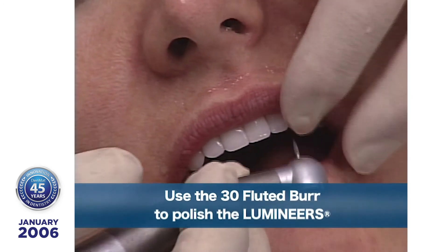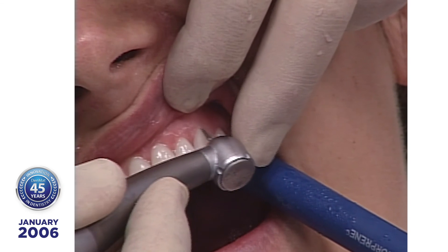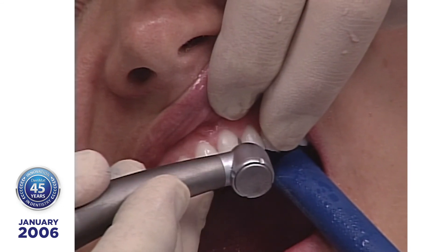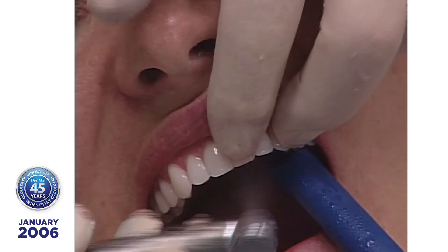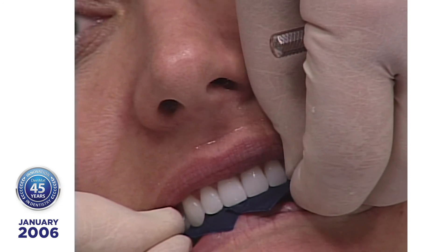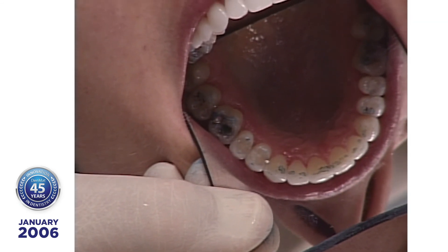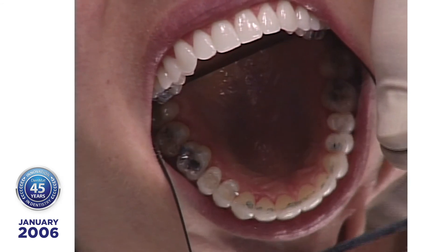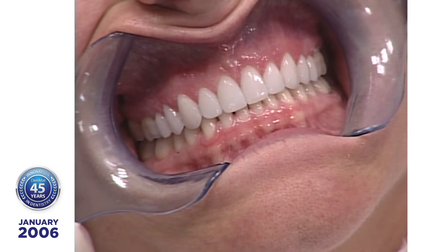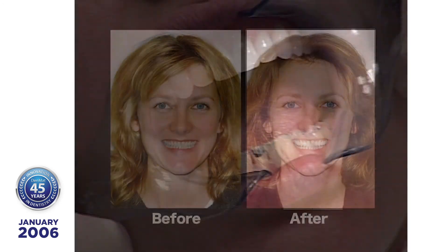Now we'll take the diamond polishing paste and grind that around — grind your teeth all over, forward and back. We've adjusted the occlusion and we don't have any blue marks on there — blue marks would create a fracture proneness. On our subsequent visit we can make more changes and we can do her lowers.